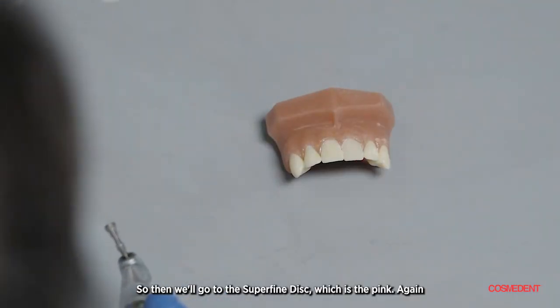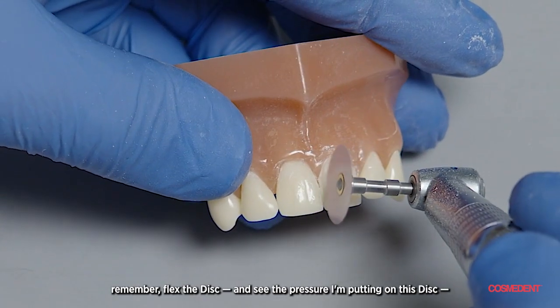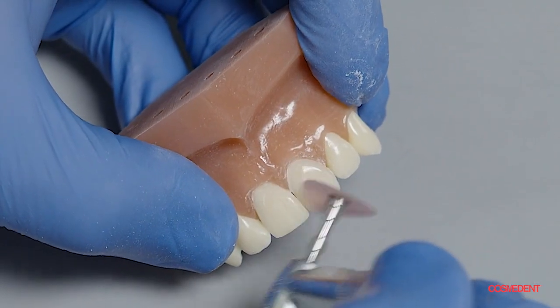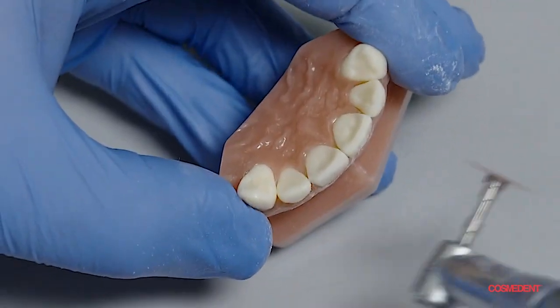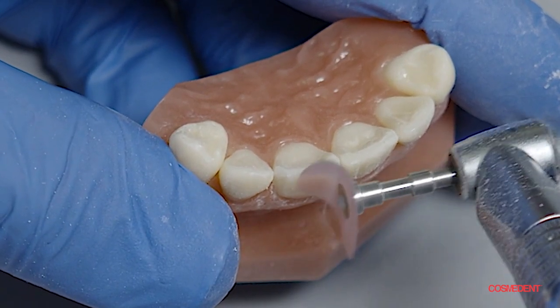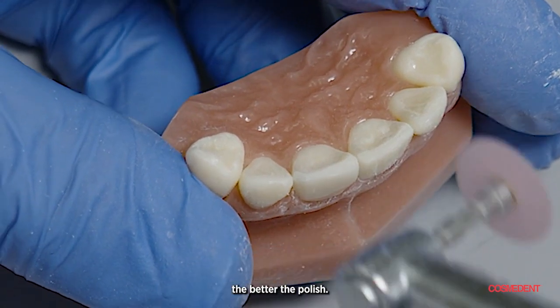Then we'll go to the superfine disc, which is the pink. Remember — flex the disc. You see the pressure I'm putting on this disc? The more flex you put on the disc with the fine and the superfine, the better the polish.